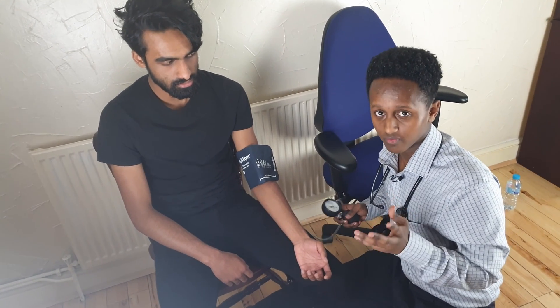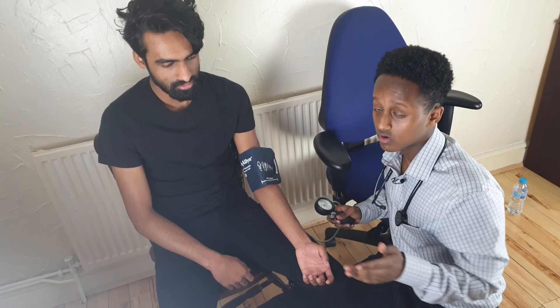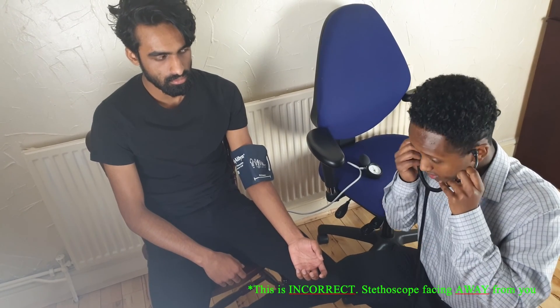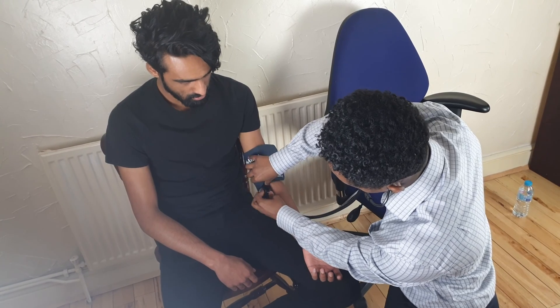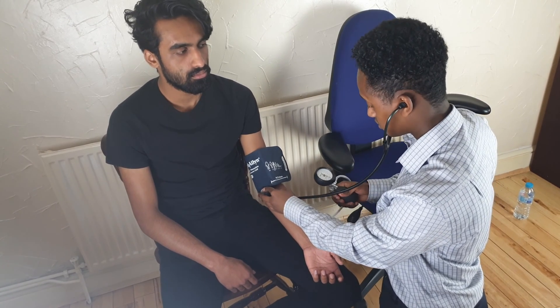Now that I've found the radial pulse estimate for the systolic value at 120, I'm going to inflate about 15–20 above that, then come down. At the first point I hear a sound, that's the systolic value, and at the second point where it disappears, that's the diastolic value — the pressure where the heart is relaxed, resting, and the blood is filling it back up. Get your stethoscope, make sure it's pointing towards you, and tap to check it's working. Place it just where the brachial artery would be — medial, just there — and tuck it underneath the cuff.